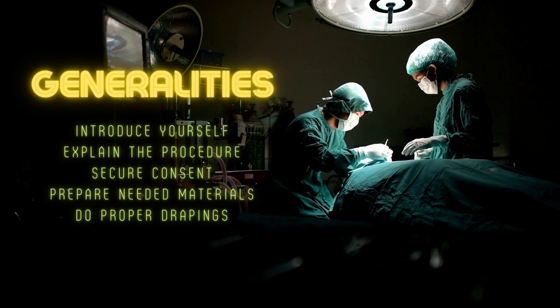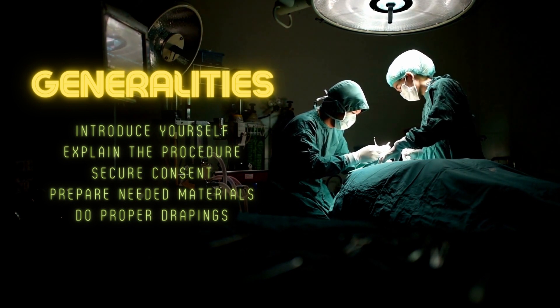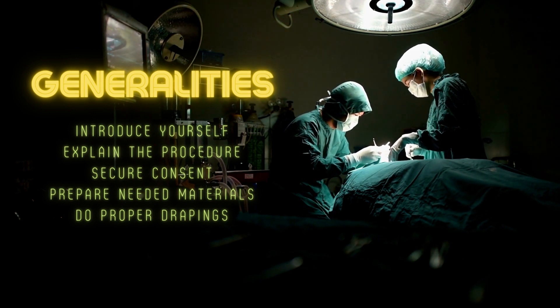Prepare the materials needed as well as the waste disposal containers for easy aftercare. Do proper drapings.